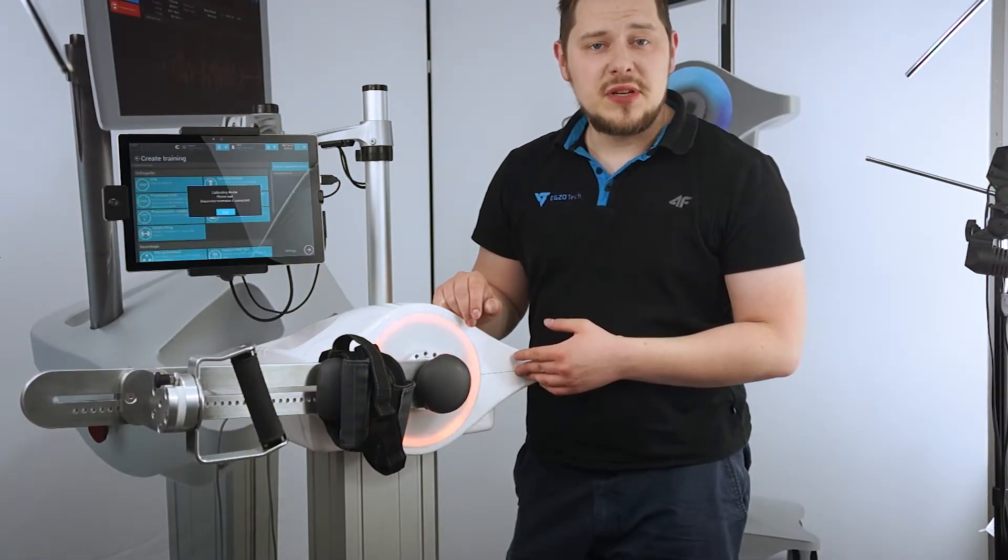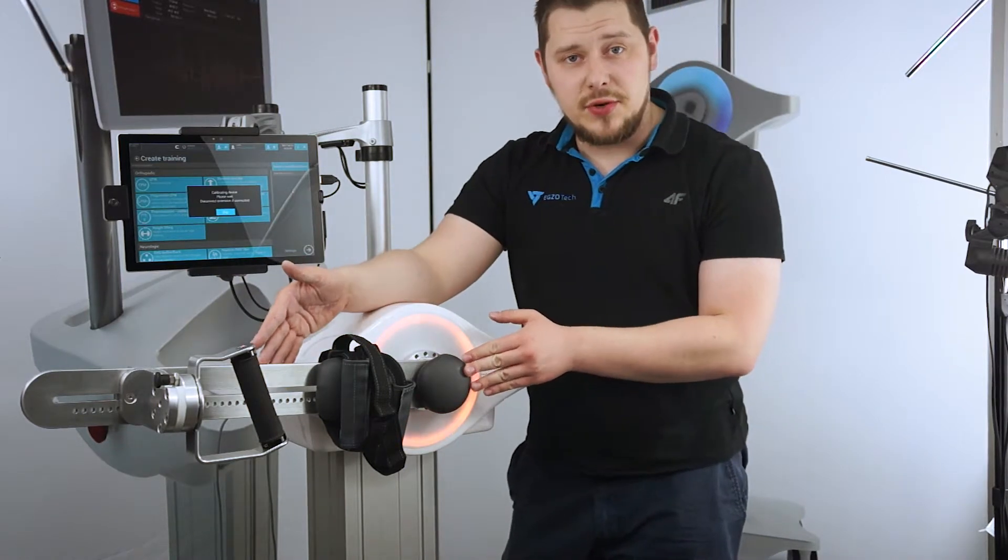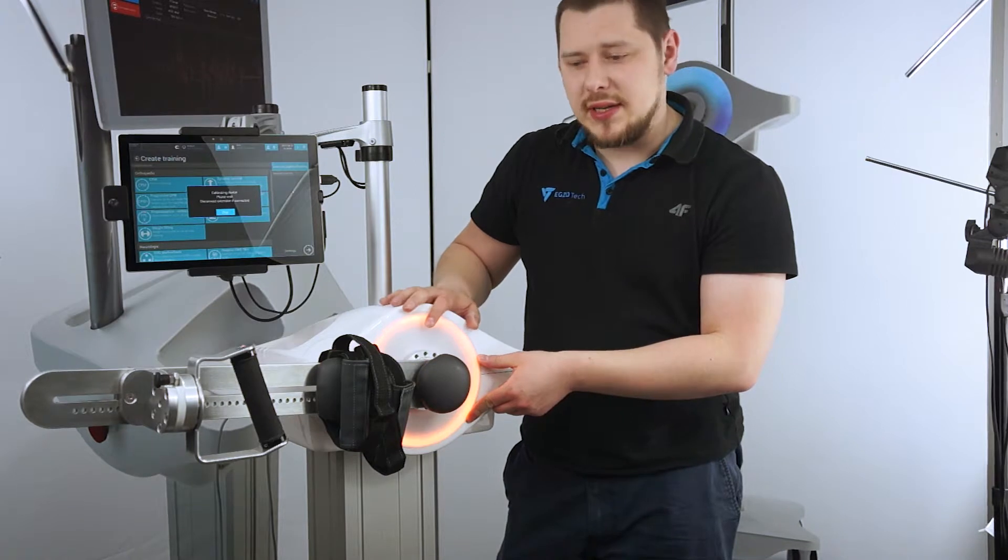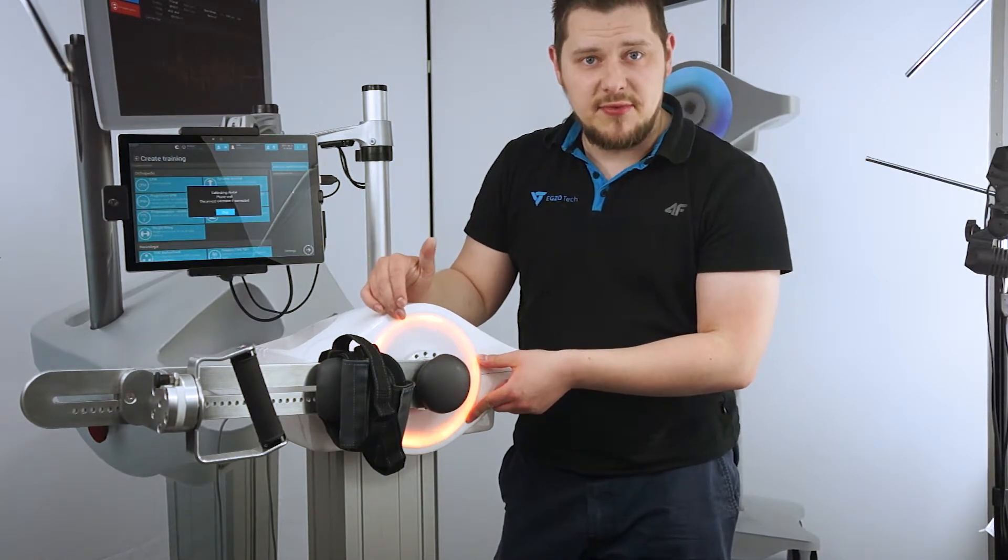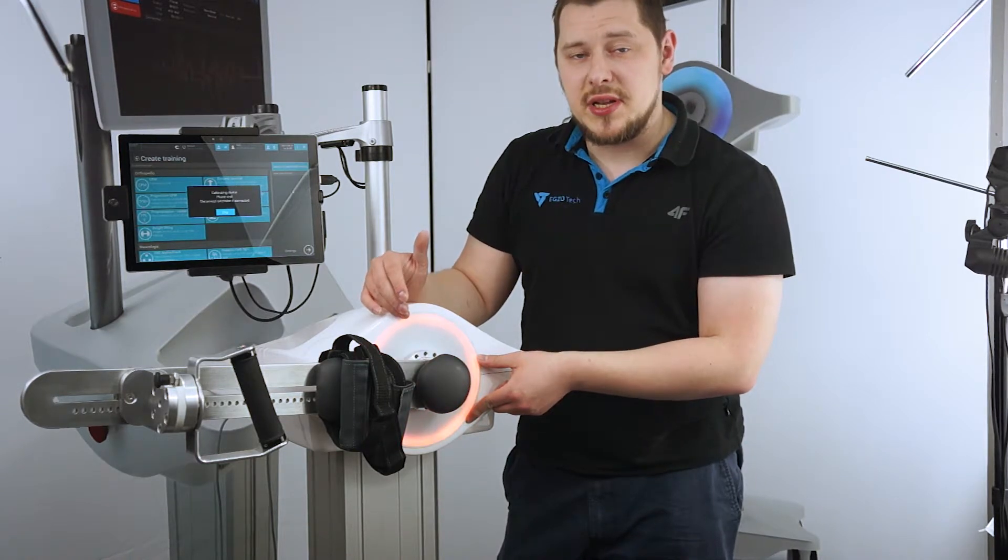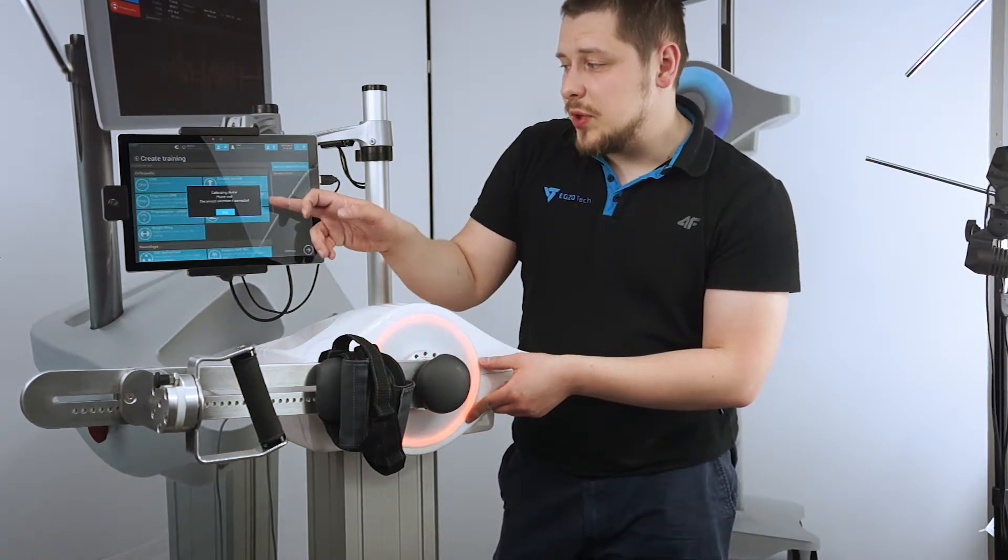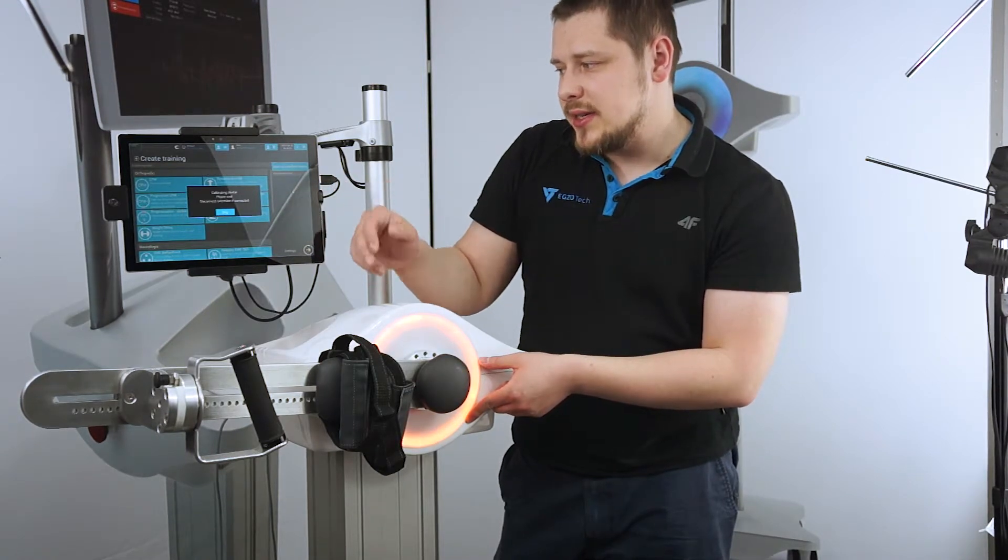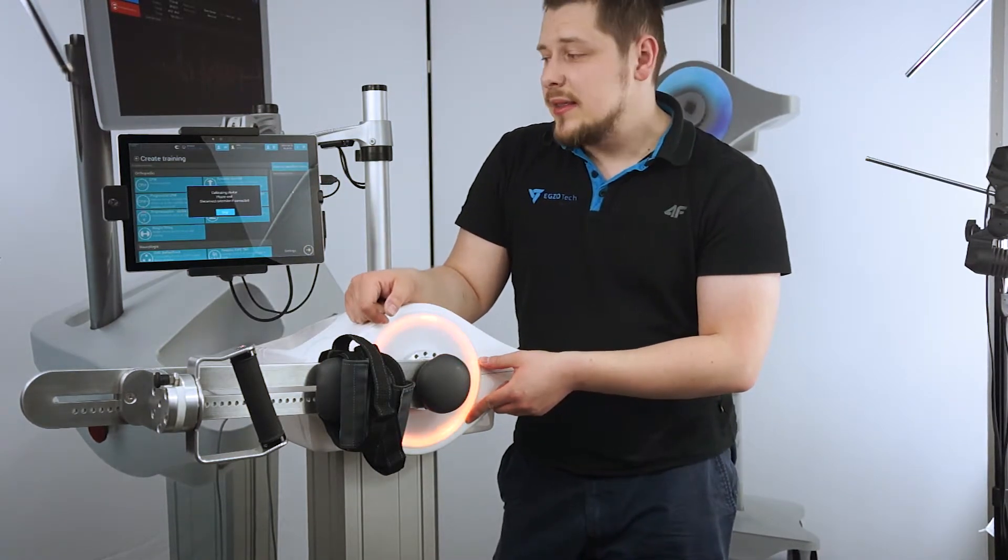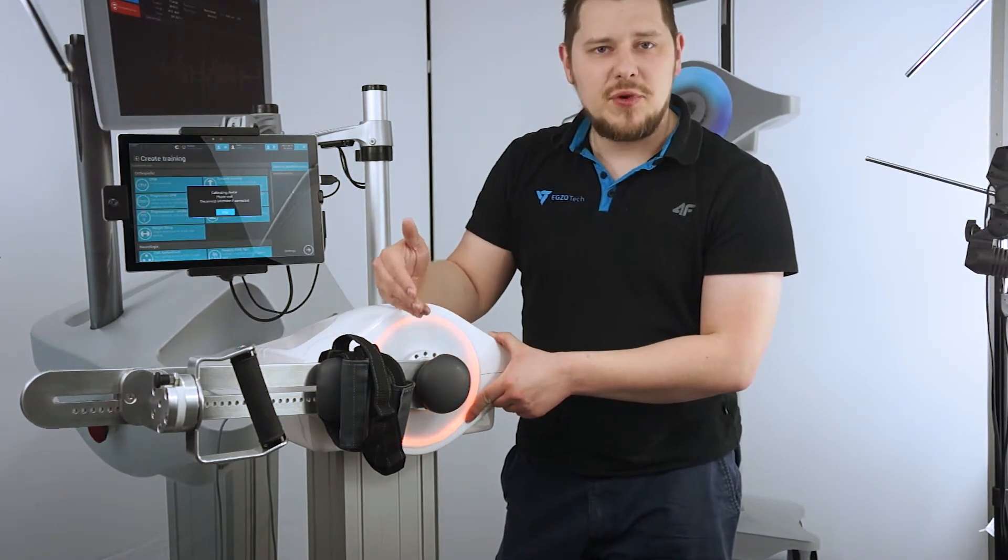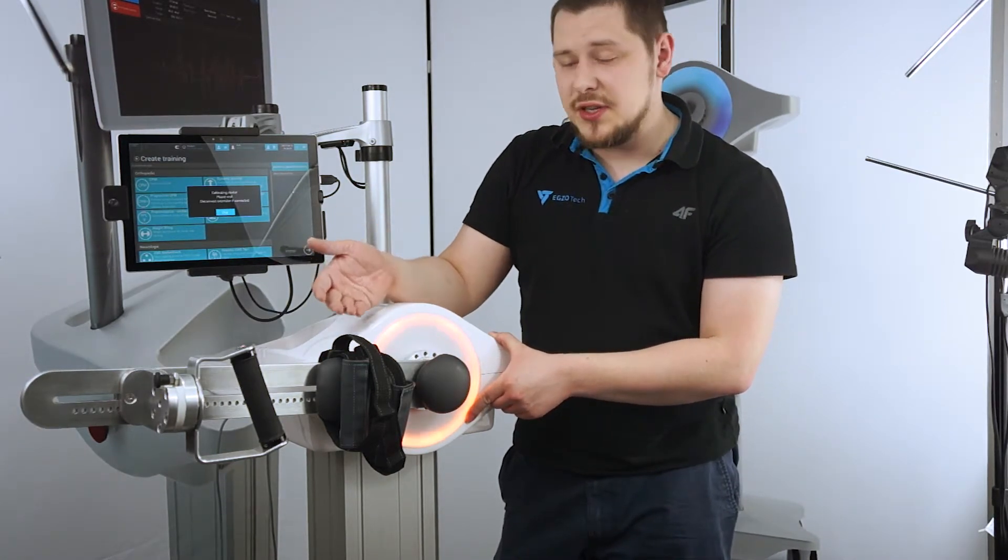From time to time, when we boot up Luna with an extension already connected, you can see an orange warning light pulsing from the lettering up front. That means that something is happening with Luna and she needs your attention. On the screen, we can see a notice: 'Calibrating device, please wait. Disconnect extension if connected.' That means that Luna wants to calibrate its sensor and there's something preventing her in doing that.